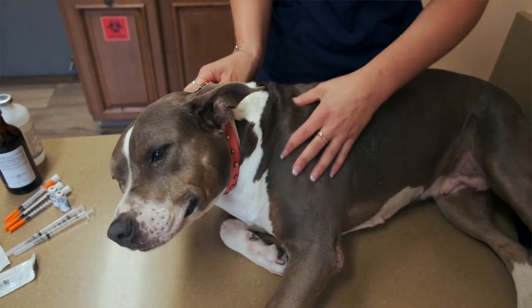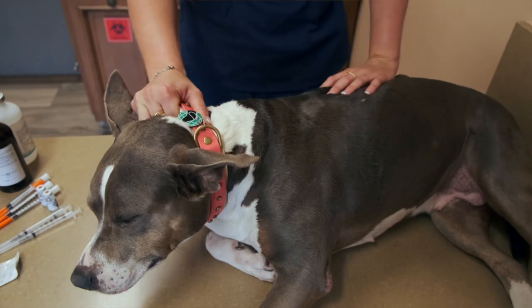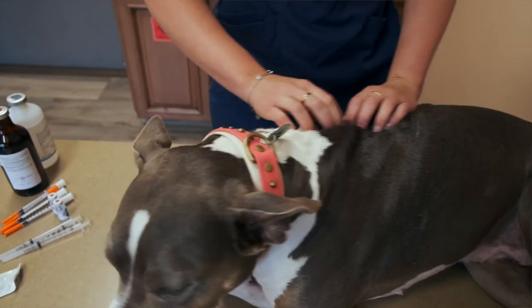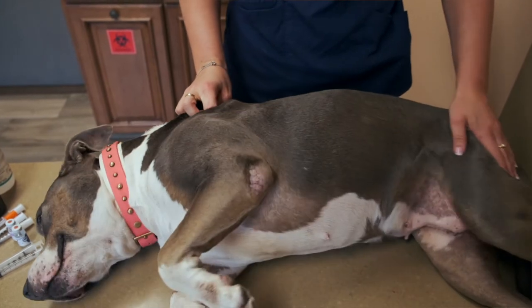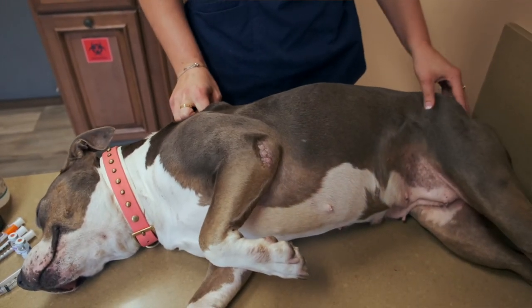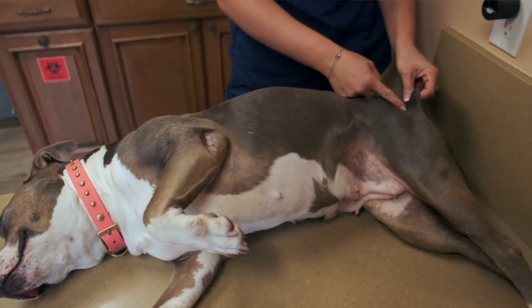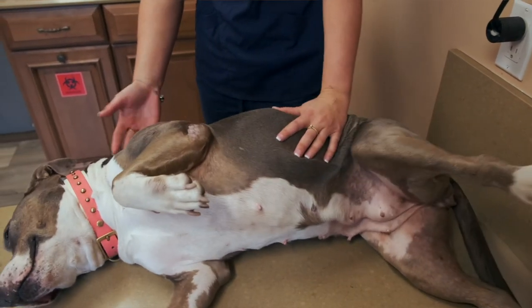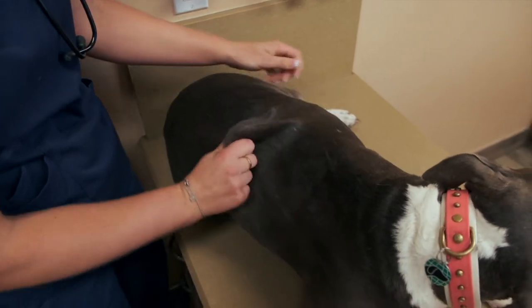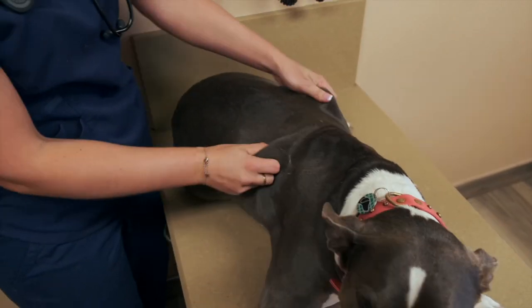The areas to give a sub-q injection would be along the shoulder blades, which is a common area to give vaccines. In between the shoulder blades and along the back is a great area for an insulin shot or any other sub-q injection. Along the lumbar region, either side of the glutes, you can also give a sub-q injection. Really, you can give a sub-q injection anywhere you can pick up that subcutaneous skin layer of your pet.